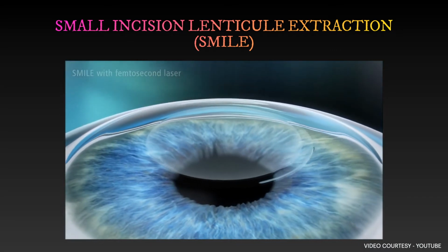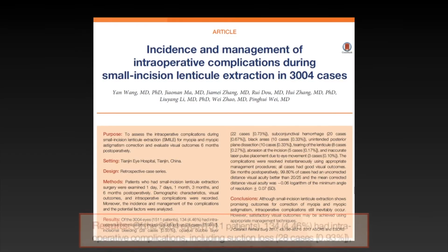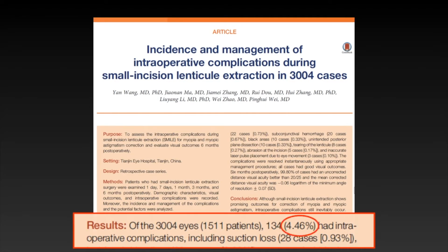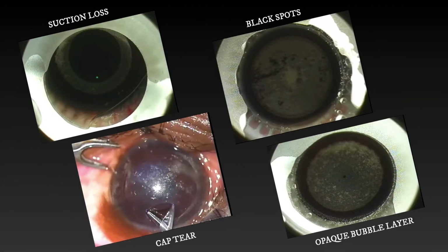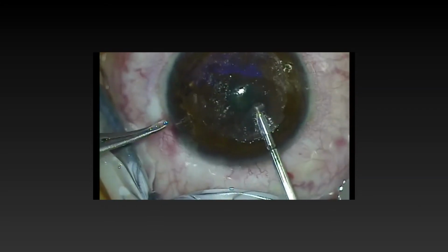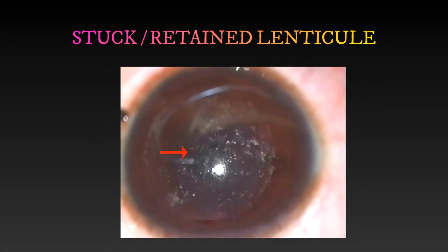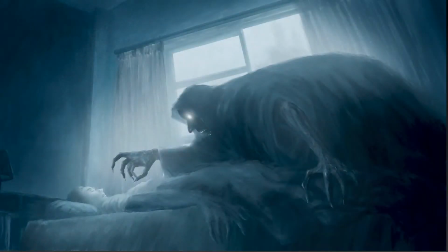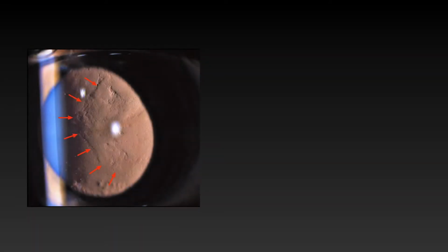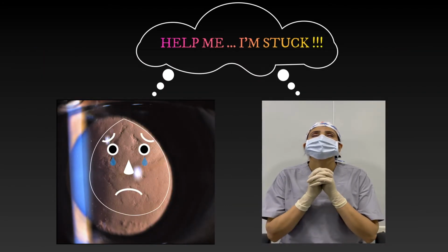Small incision lenticule extraction or SMILE is generally considered a safe procedure with a low incidence of intraoperative complications in the hands of expert surgeons. Of the potential complications of SMILE, failure to extract the lenticule or a part of it presents as a unique complication known as stuck or retained lenticule. This challenging situation can be a nightmare for even the most experienced surgeons, wherein both the lenticule and the surgeon are stuck and need help.